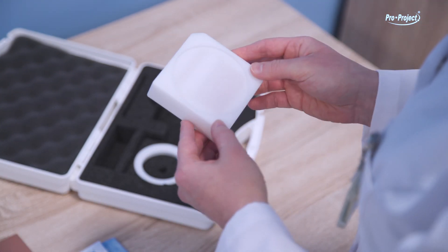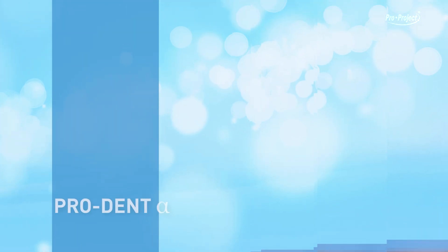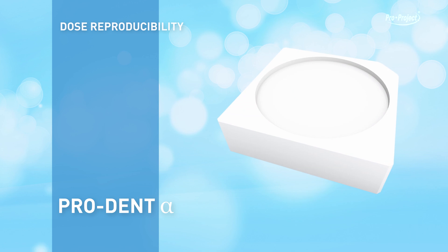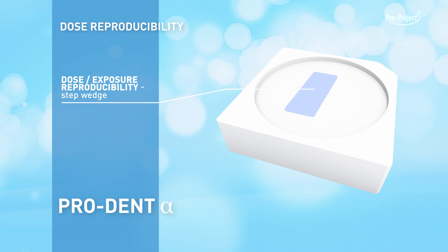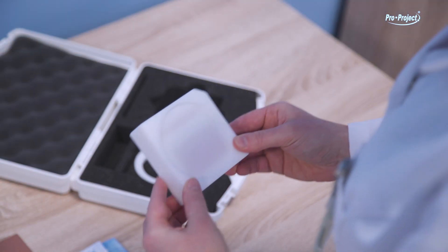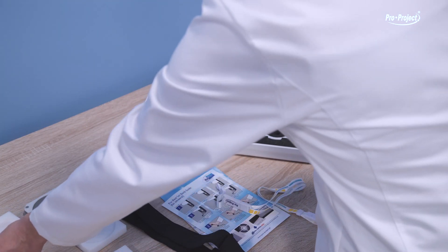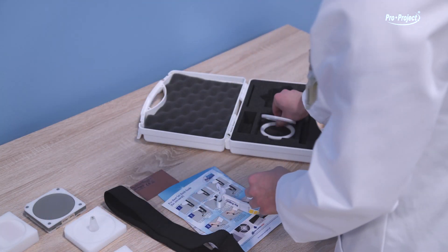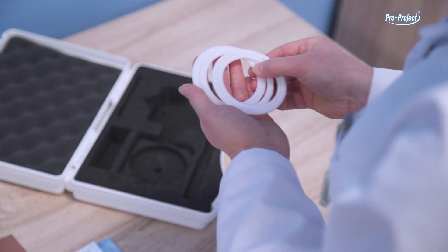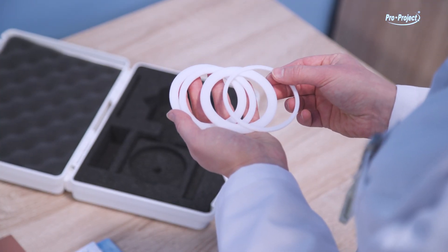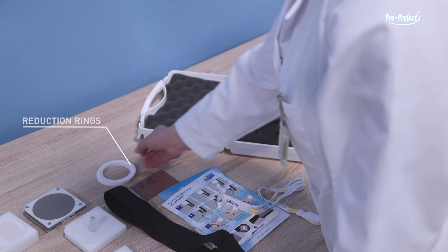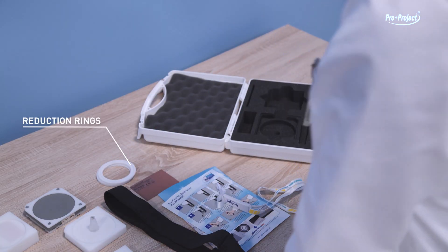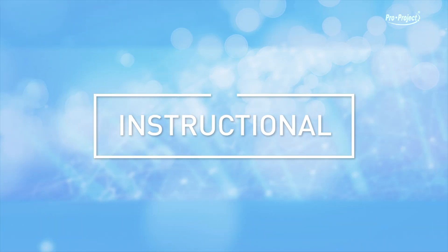ProDent Alpha: dose reproducibility, dose exposure reproducibility, step wedge radiology range, source reduction rings, antibrial range.